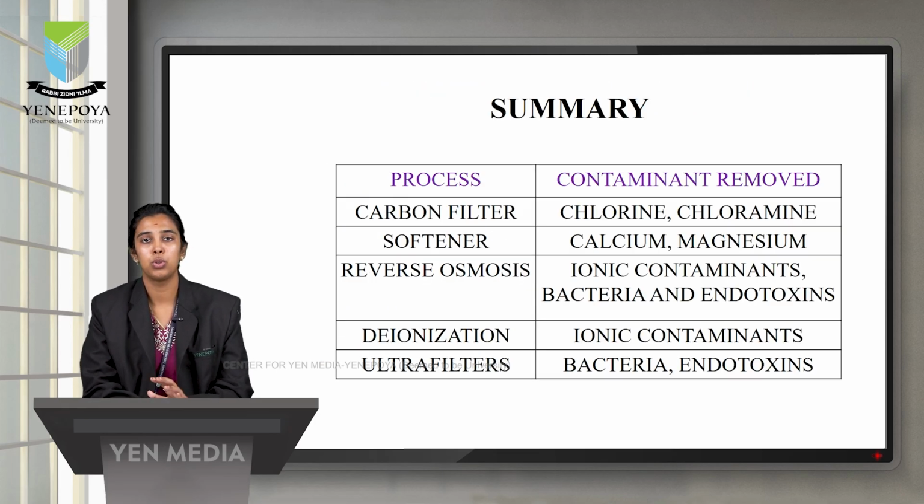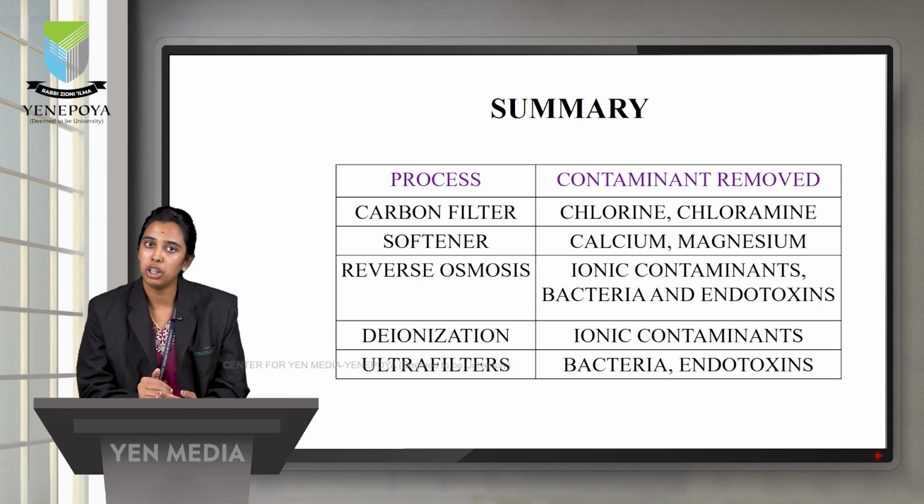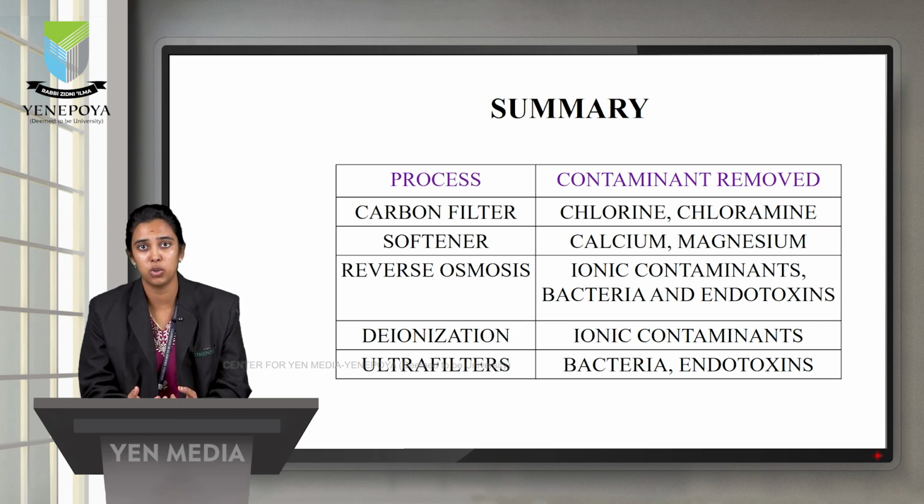So these are all the things we spoke about regarding water treatment. In summary, we covered how many liters of water we use for a dialysis patient, and why there is a great need for the water to be treated. We have many processes to treat the water, because the level of contaminants can cause serious diseases and serious side effects to the patients.